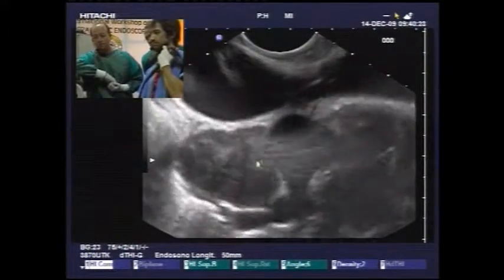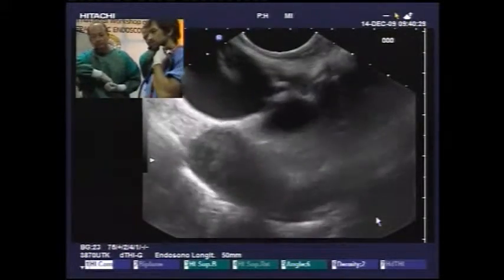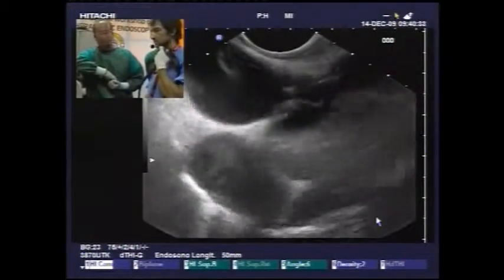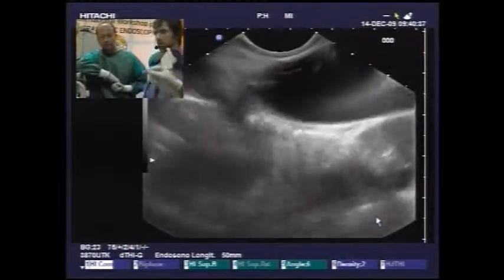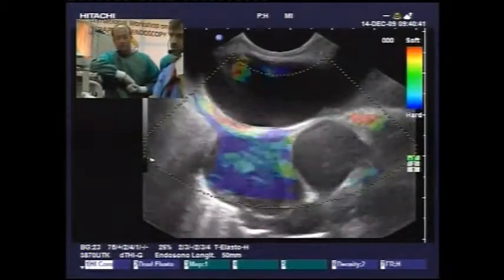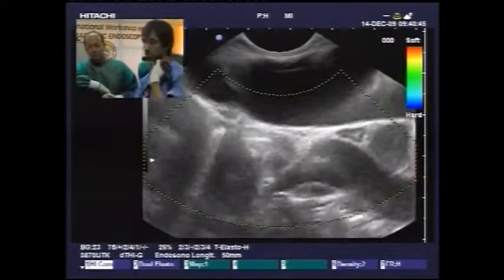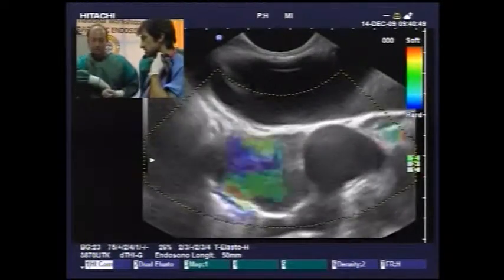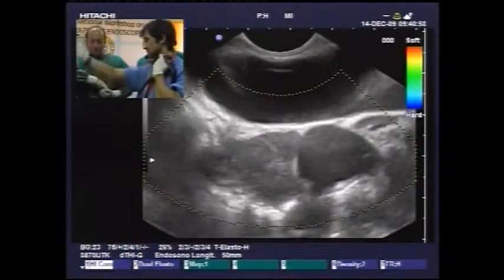Naji, this is a pigtail stent, so it has a pigtail at one end and is straight at the other end. Exactly. It's a pigtail at one end so that it stays in the lumen. And you can see it now coming out endoscopically. And we'll also check fluoroscopically. You have to gently pull on the wire, and fluoroscopically check. You can see the stent going in now.